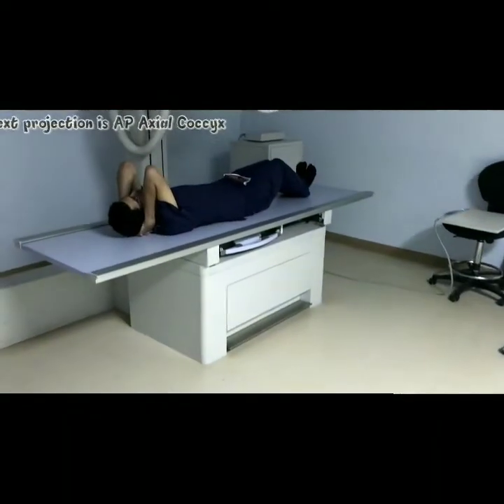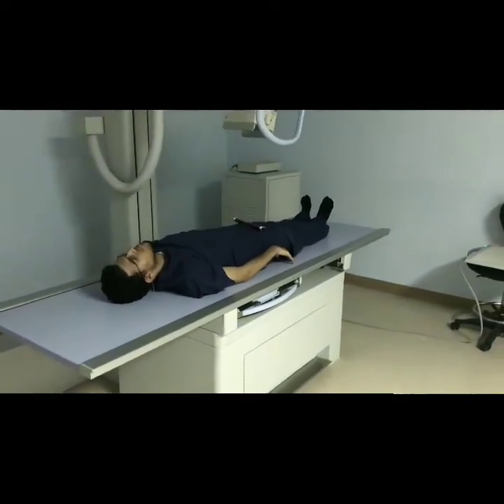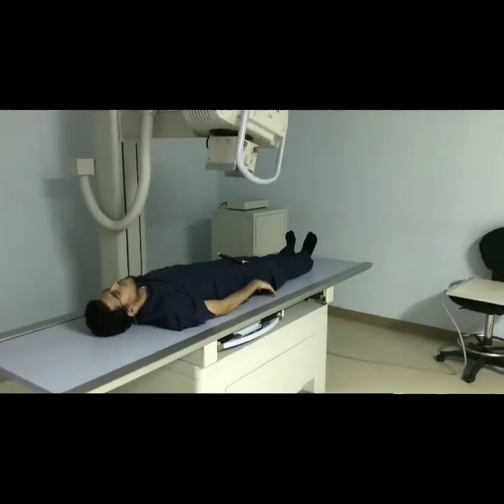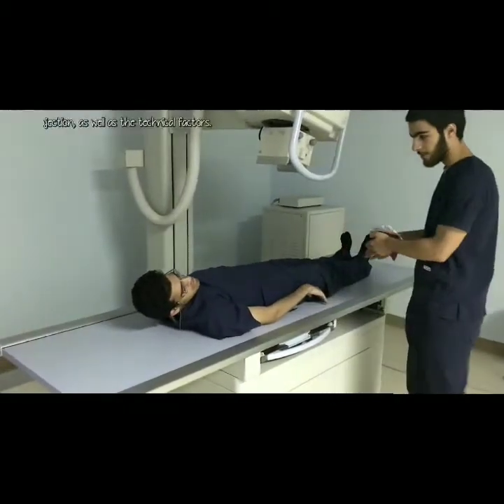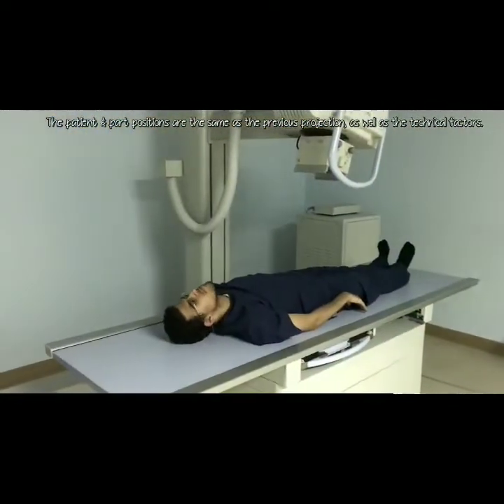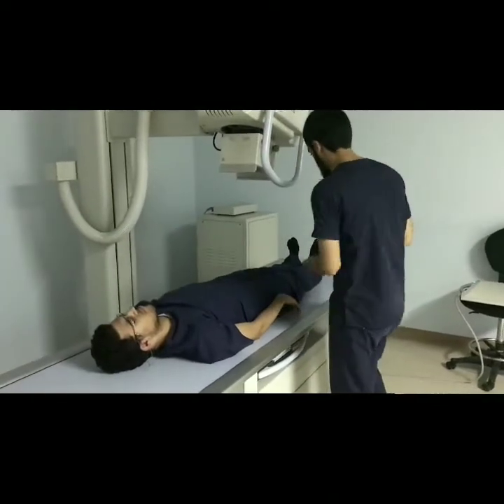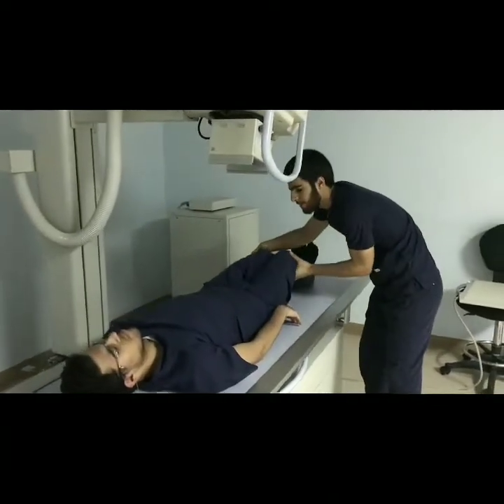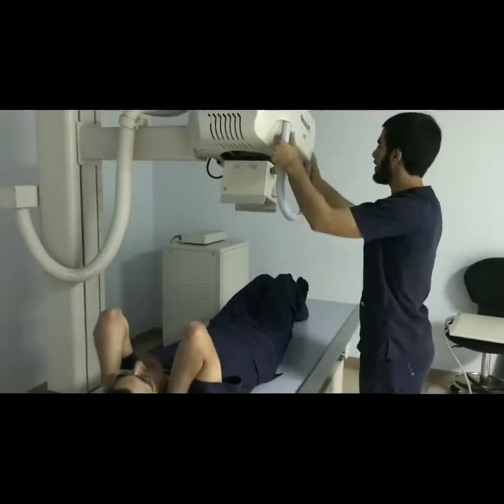After making the exposure, call for the patient to relax because the position might have not been most comfortable for him. Come closer and inform the patient about the next step briefly. Tell the patient to repeat the previous position if he can't recall it, and help him doing that.